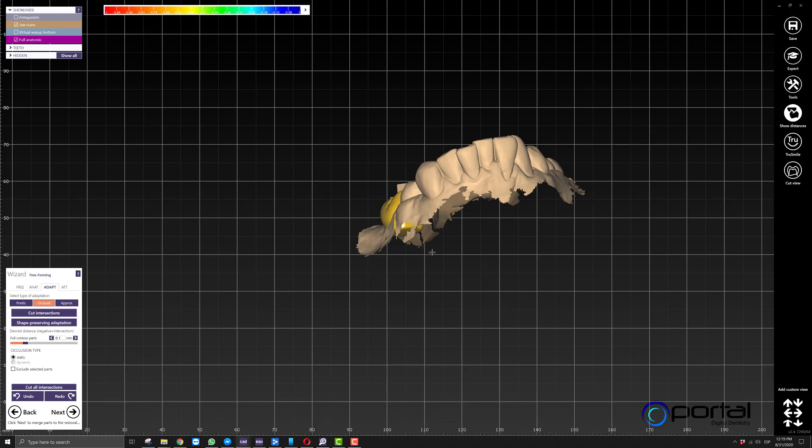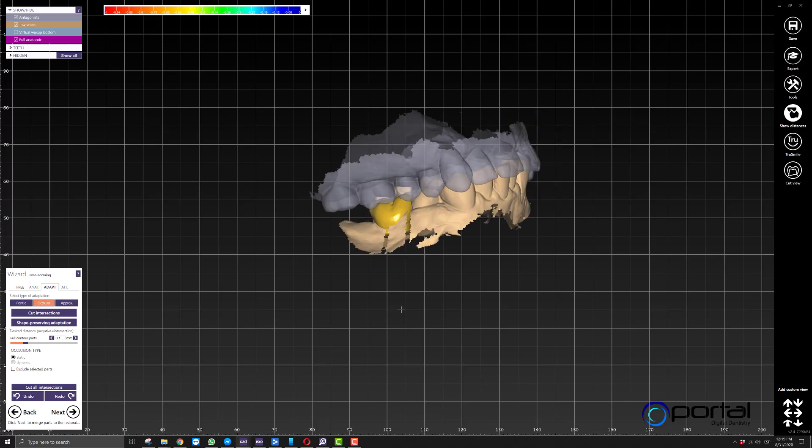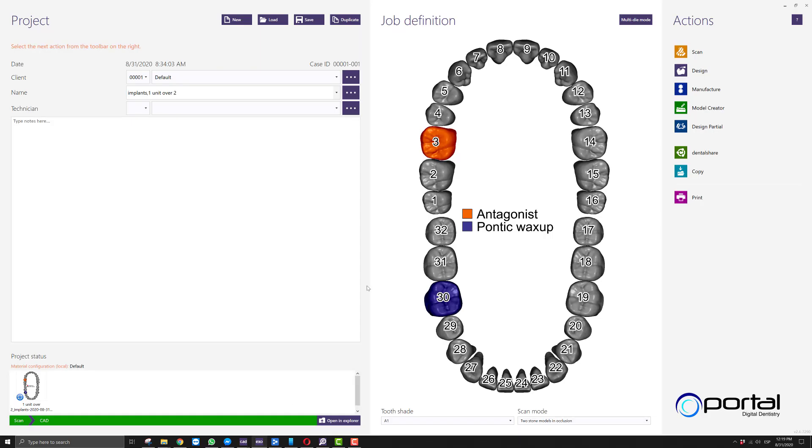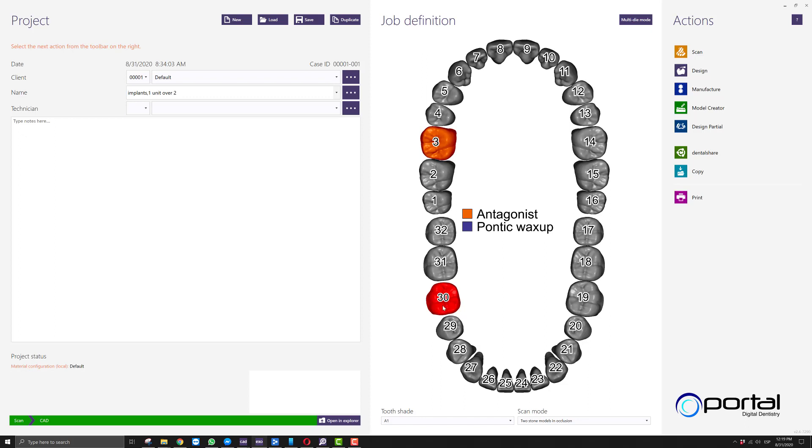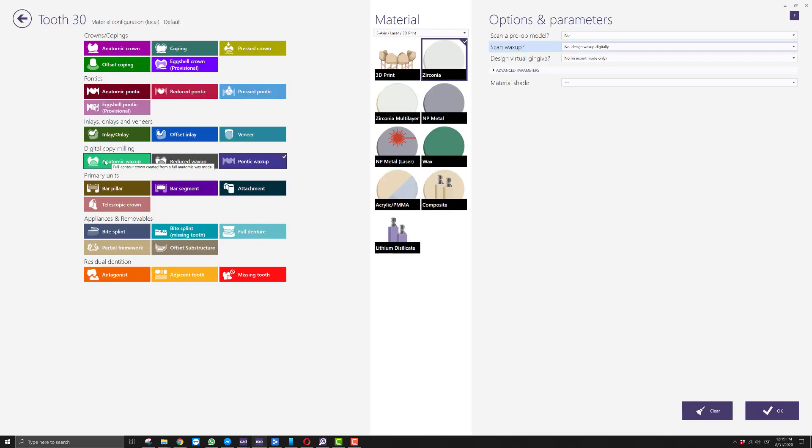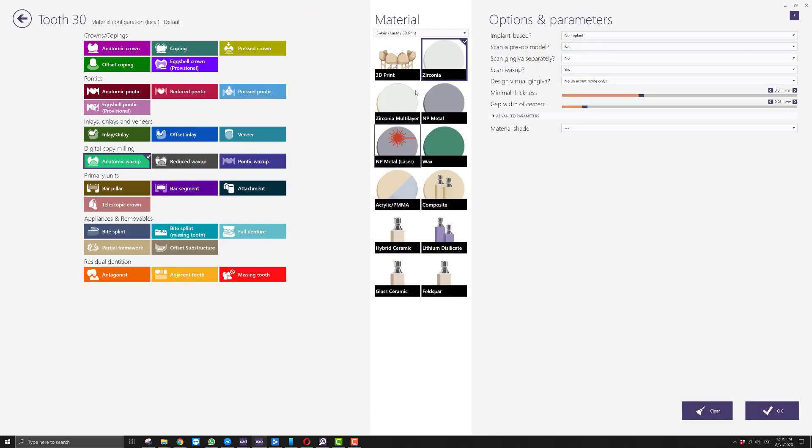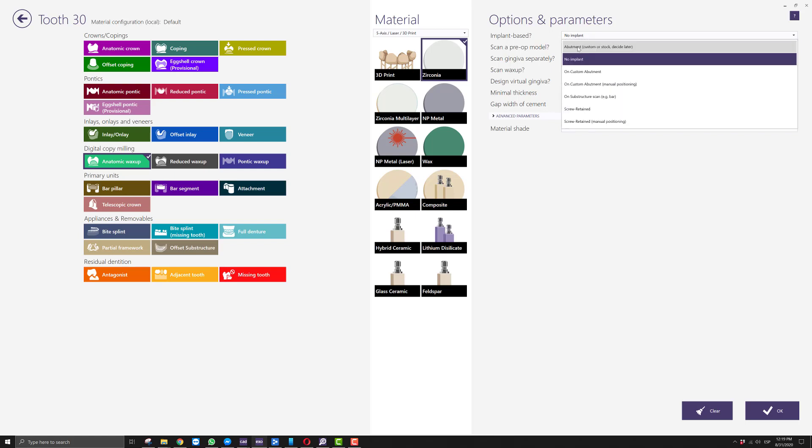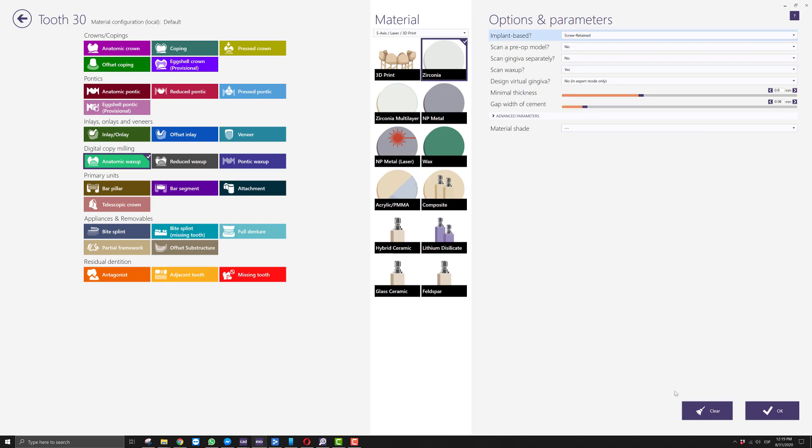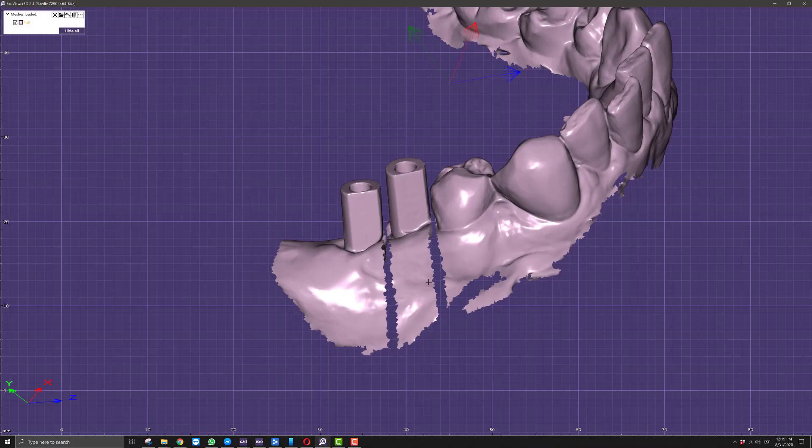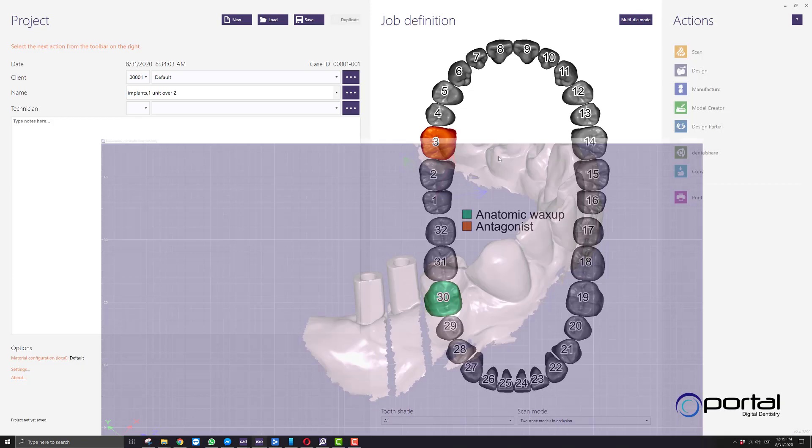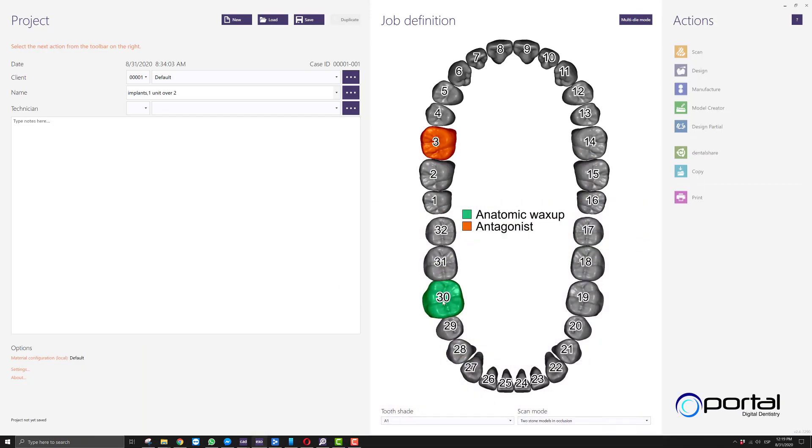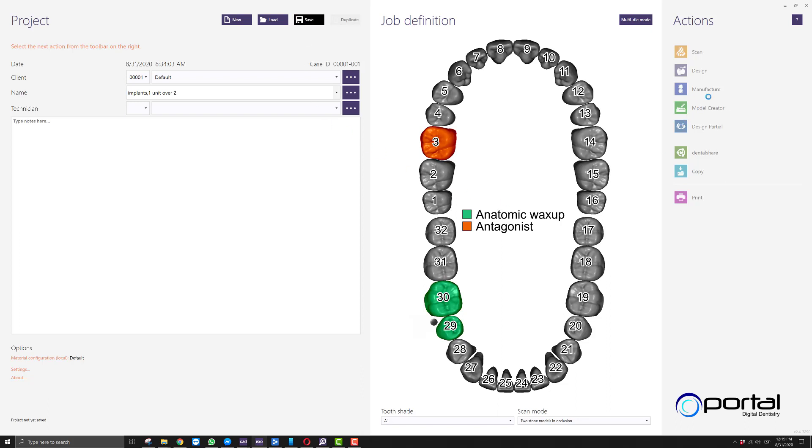Now we'll minimize that and go back to our order form. Here we're going to make the following change: for number 30, we'll go to anatomic wax up. The material matters depending on what the final product will be. Where it says scan wax up, this time we'll say yes, we are going to be scanning it. We'll also say this is going to be screw retained. Because our case has two implants, we have to select two options of a screw retained crown. We can use 29 or 31—doesn't really matter.